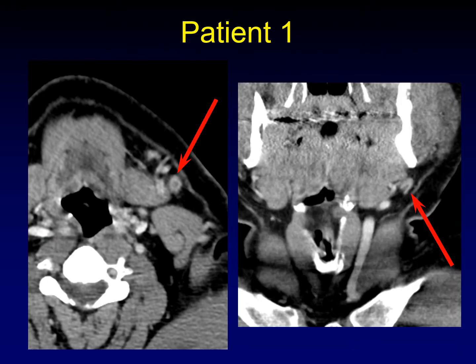Okay, here's patient number one. This time I'm going to give you a coronal reformat of the exact same node so that you can see that what looks like necrosis in the center of the node is, in fact, partial volume of a fatty hilum. You can really see that it's a fatty hilum when the image is reconstructed into a different plane. That is partial volume of a normal fatty hilum in a perfectly normal lymph node.